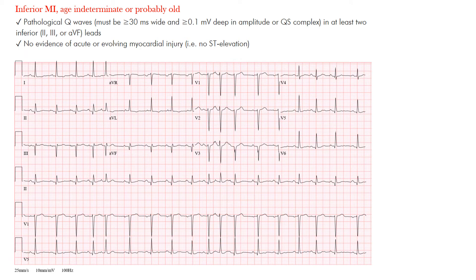Inferior MI, age indeterminate or probably old — we're not looking at something acute, but one we want to keep in mind and make sure is not a new change when the patient presents. If there's an old EKG available, we always want to look back and compare to the most recent. In this inferior MI, what we want to see are pathological Q waves.